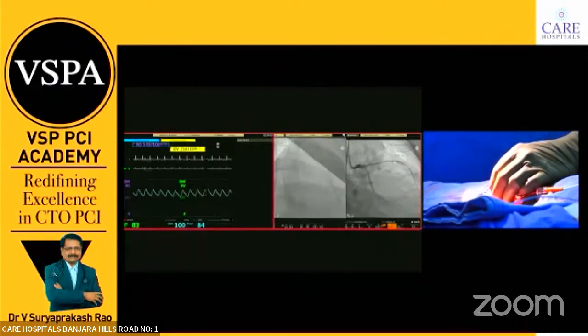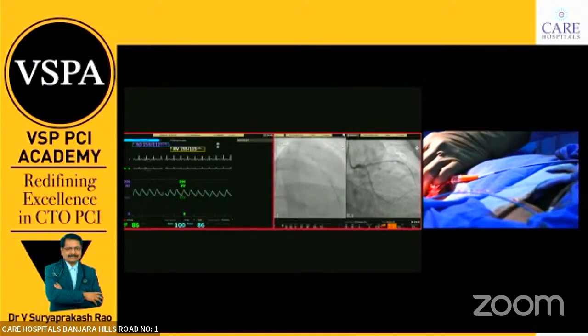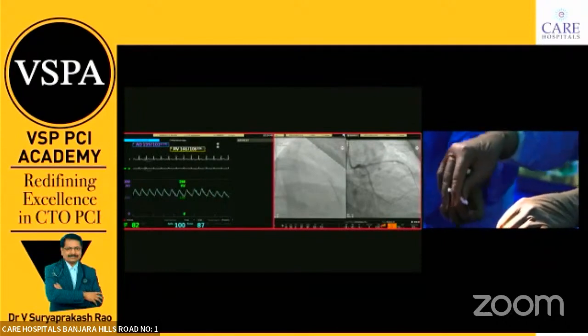Take the IPS again after 3. This is because of his obesity. But we put a rad pad, it absorbs at least 50% radiation. How much radiation can the rad pad absorb, Santosh ji?